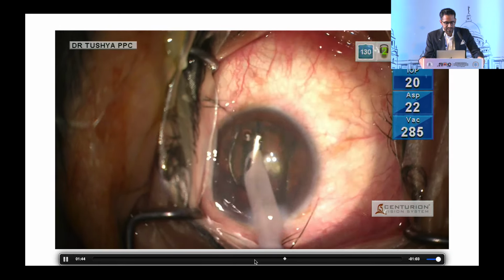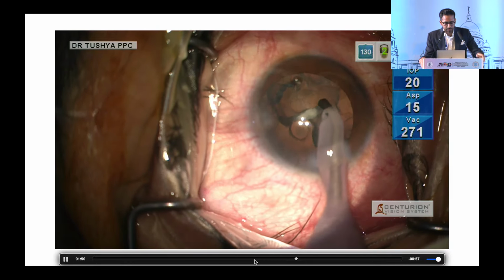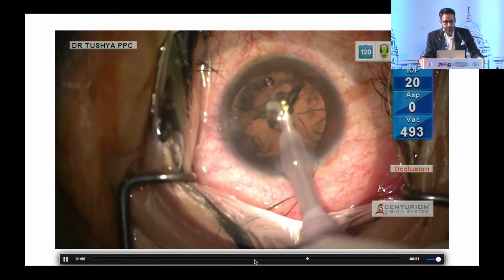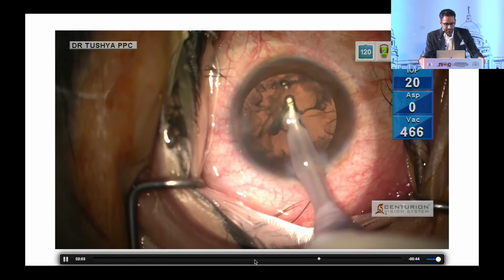of irrigation and aspiration. And what I did here was, there was a thick epinuclear sheet also, which was giving me an advantage and providing a scaffold to the PCR. And once the epinuclear sheet was dislodged from all the ends, it is aspirated swiftly.